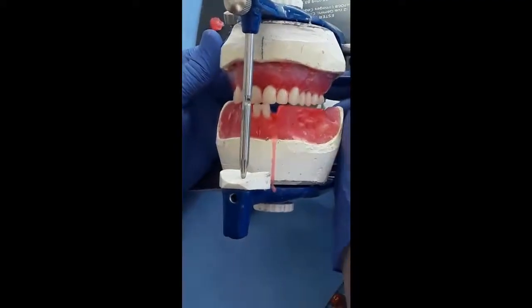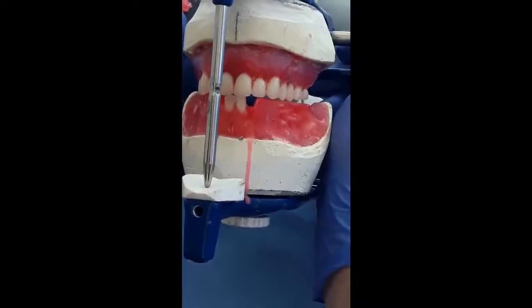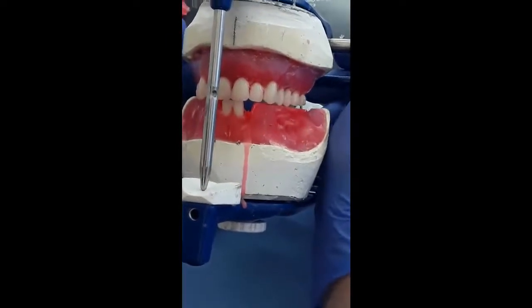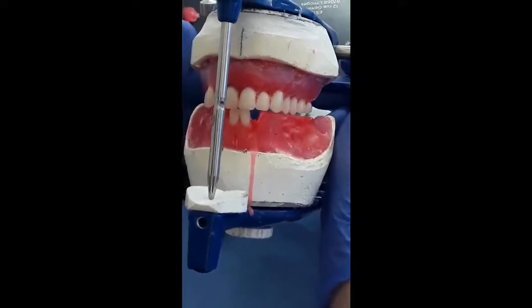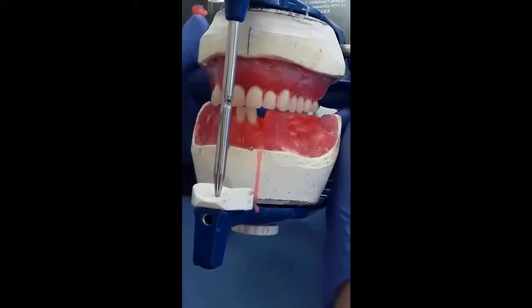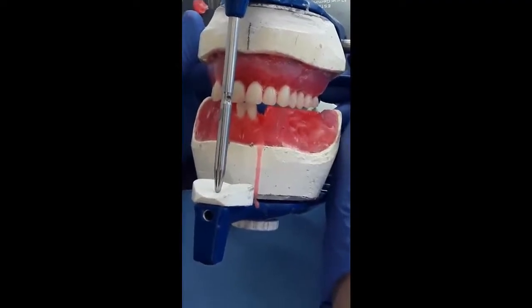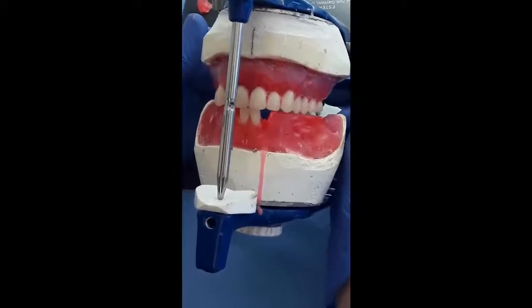Now you can see that I can achieve edge-to-edge contact without separation of the pin and without movement of the teeth. Now the teeth are in a soft, warm wax. If there is no mechanical protection for these teeth provided by the movement of the incisal pin on the incisal guidance table, the teeth will move. Now all I have is brush contact.